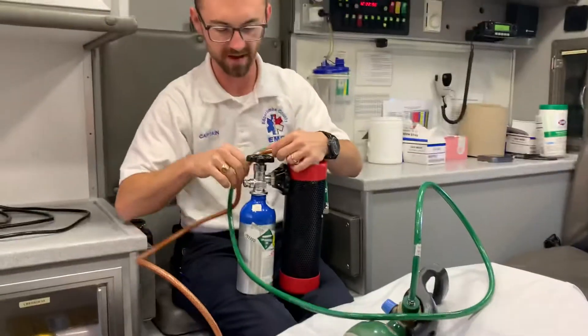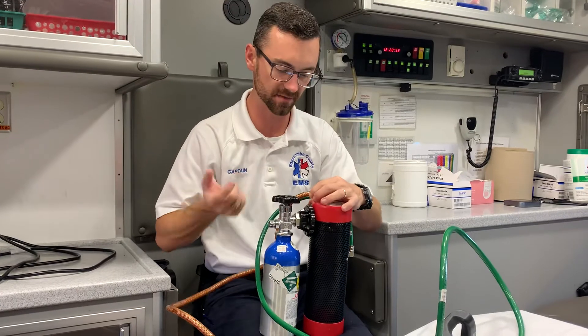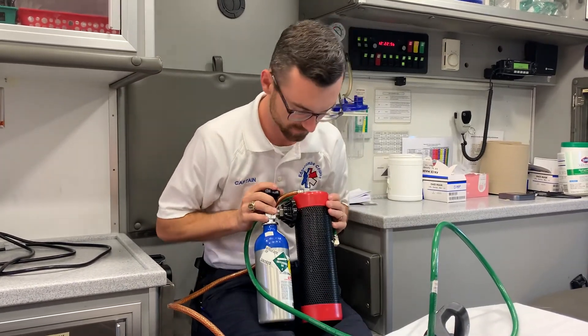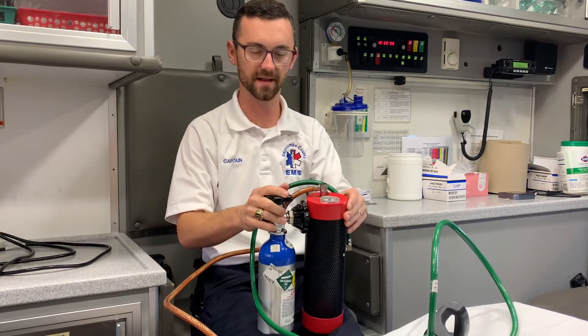If you get a leak, it's probably coming from here or here — just try to tighten it up. If you have to, cut the pressure, then tighten it up, then turn the pressure back on, and it should fix. And that's it.